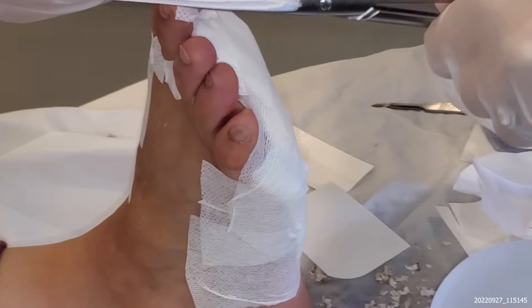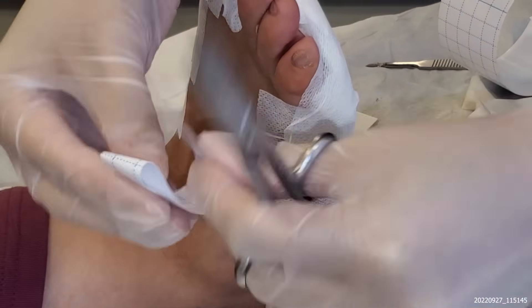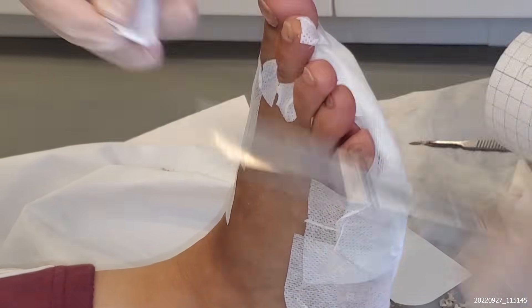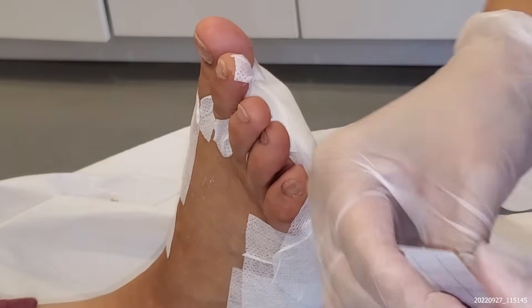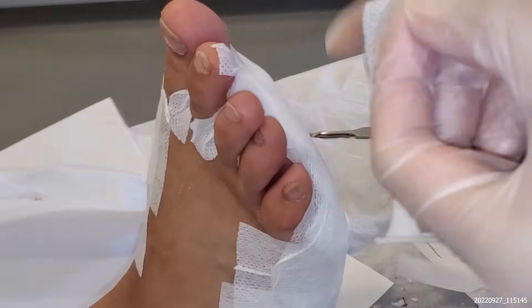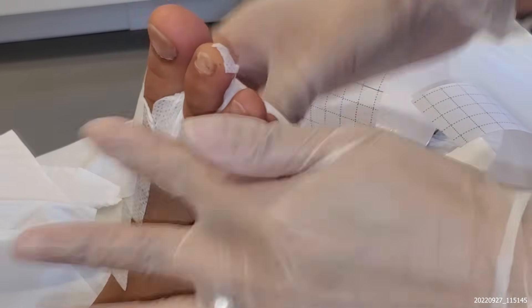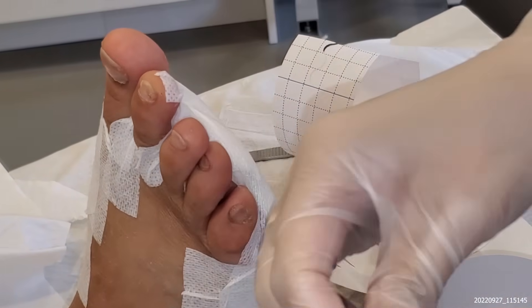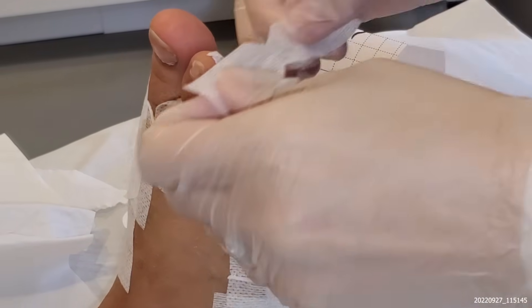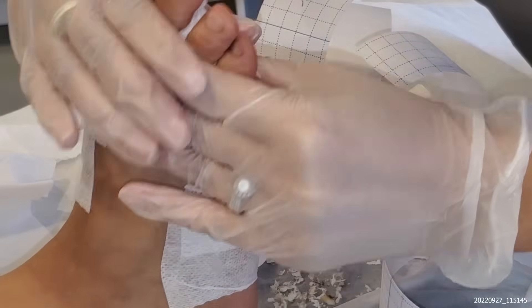So I'm just cutting and putting the dressing in between the toes. You leave the dressing on for one week — you walk around and it comes off — so you want to extra secure it. You create these little tiny corners; it just allows it to slot in very easily. You want to make sure it's not too tight.